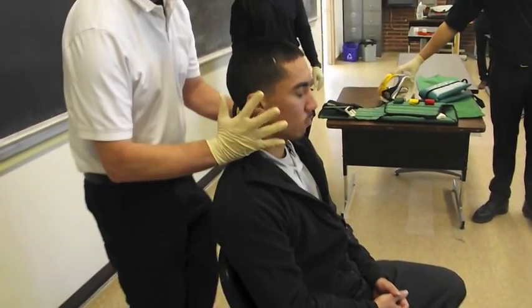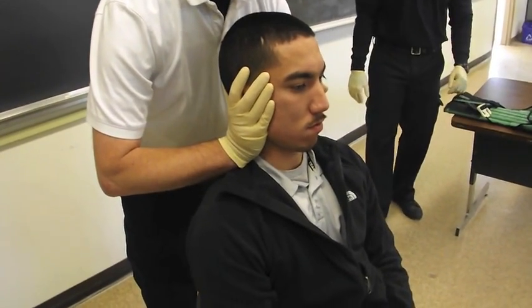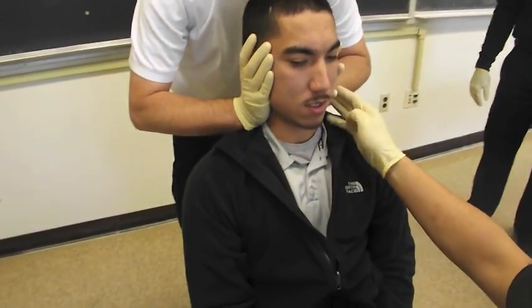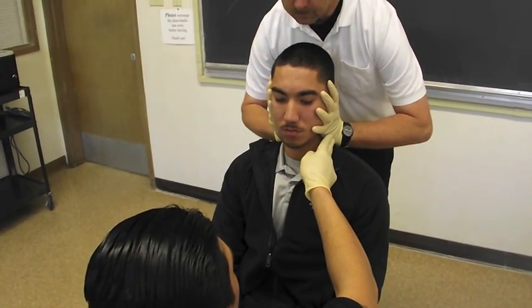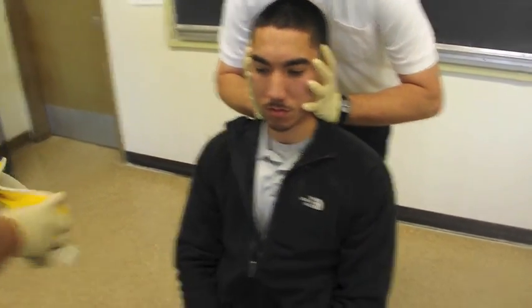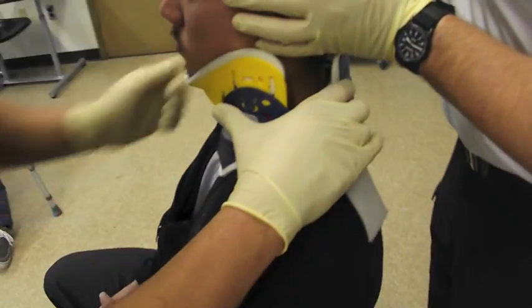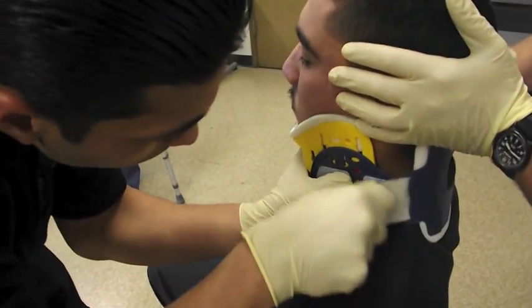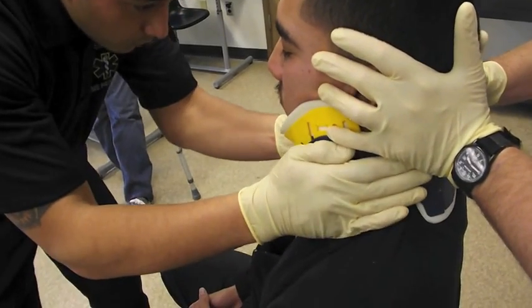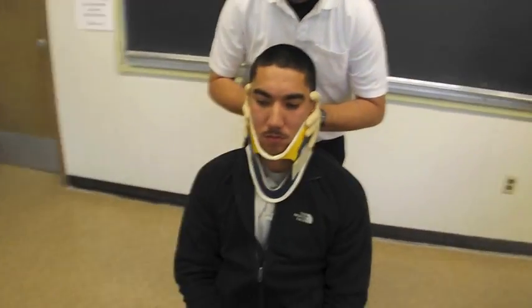First, Paul will come up and take manual C-spine. Marcus will follow and properly place the C-collar on. I'm going to put the C-collar on you to make sure we keep your spine in place. Now because the patient hasn't been secured yet to a spinal board or the KED, even with the collar on, we're still going to hold manual C-spine through this process.